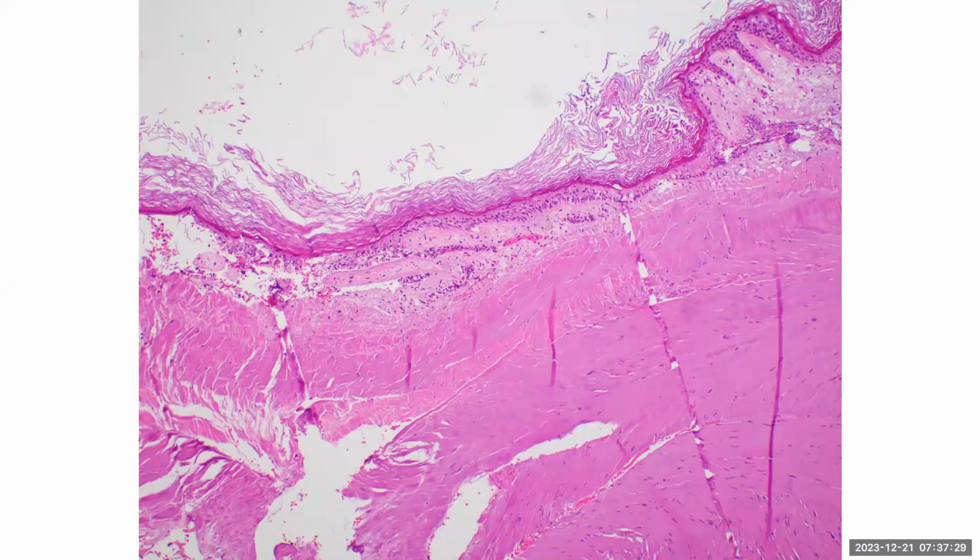So, interesting discussion. You can see here immediately in the upper part of the center, a squamous lining and some flaky keratin debris flying off that base into the lumen.